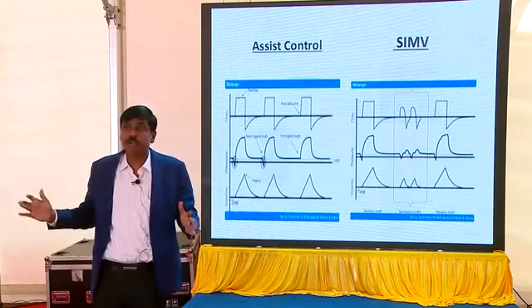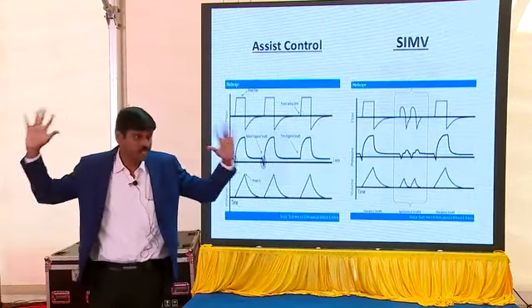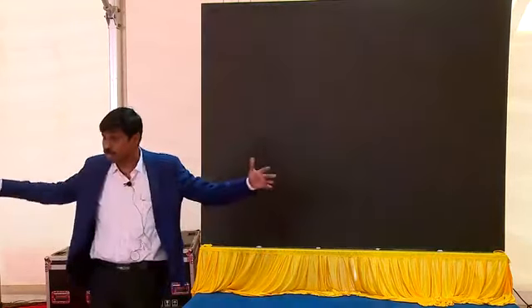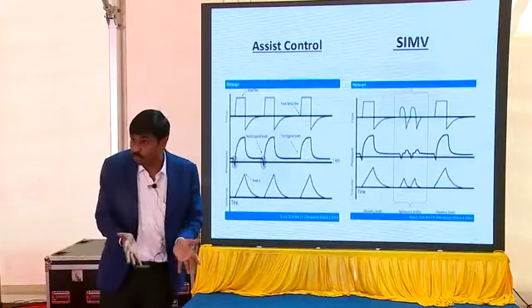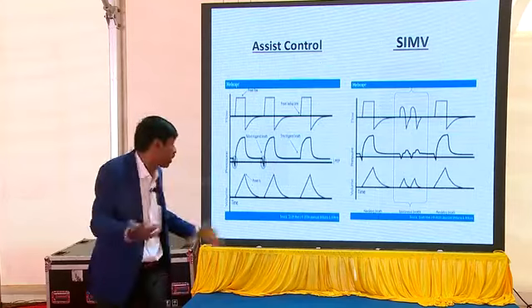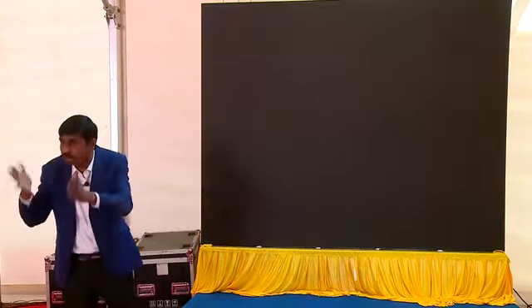So at the end of the session, we have learned a lot about high frequency HFOV. I'm going to do HFOV for all my babies? No, you need your entire team comfortable. Similarly, your modes also. Your unit may be comfortable with one. You tailor yourself to that. Okay, coming back. So that's about SIPPV, which means all breaths are supported. SIMV means only a set number is supported.